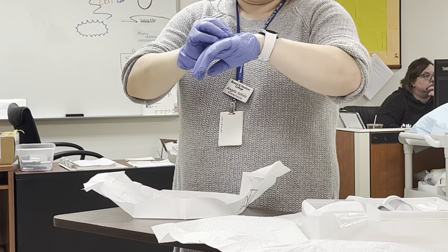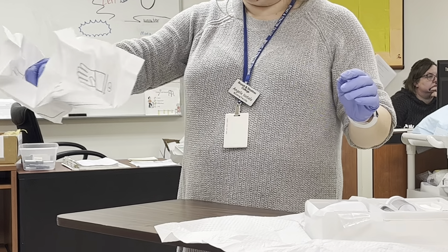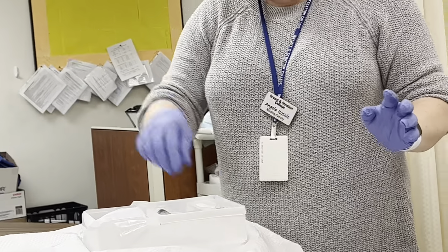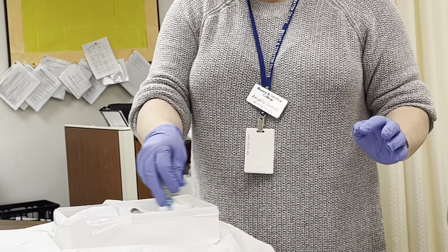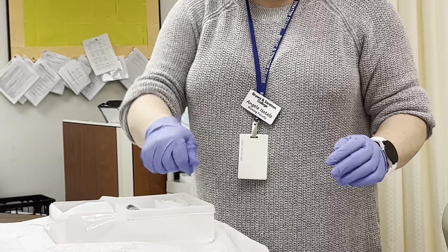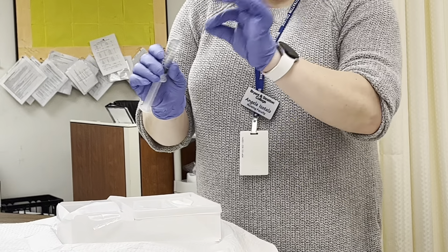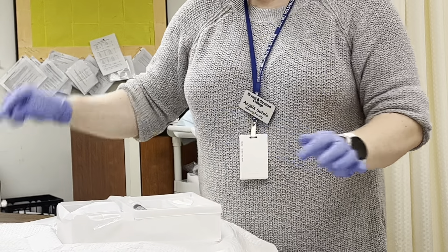I've got my sterile gloves on. I'm not going to put them below my waist. I'm going to pinch the middle and get rid of my garbage. I come to my kit — I don't need the cup. I can put the lubrication inside the kit. I'll pour the iodine over. I have my syringe and I'm just going to take off the cap and set it back inside my kit.